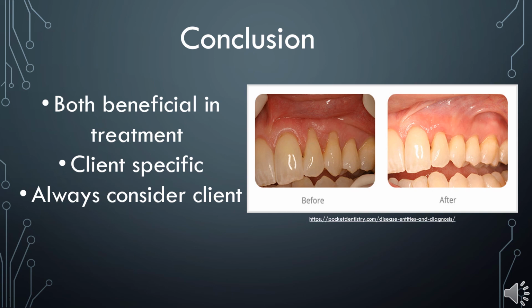In conclusion, digital radiography and CBCT, combined with assessment of clinical probing depths, attachment levels, and alveolar bone levels may increase the ability to determine the treatment outcome following periodontal therapy.